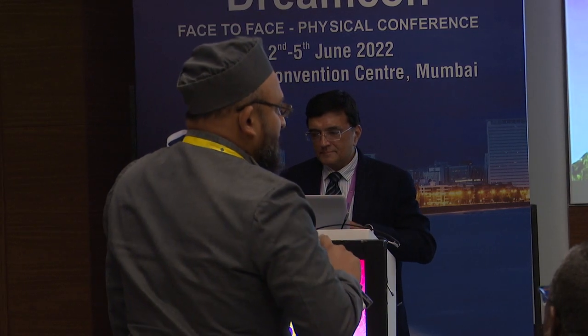I will show a video of that. At one point, I was doing a diabetic vitrectomy. First, I did the worst eye, then the patient accepted to get the other eye operated. And there was a bleed operatively. I raised the pressure for less than a minute. The next day the patient was PL negative.